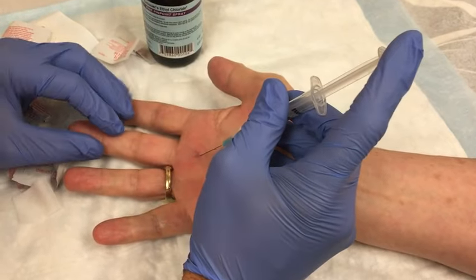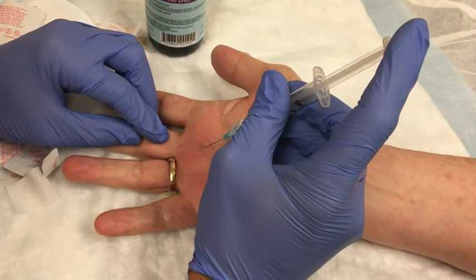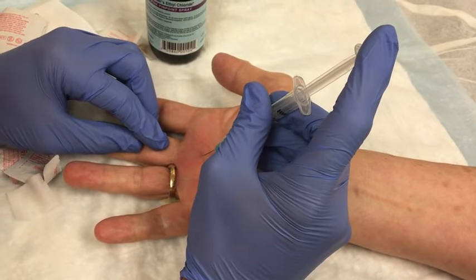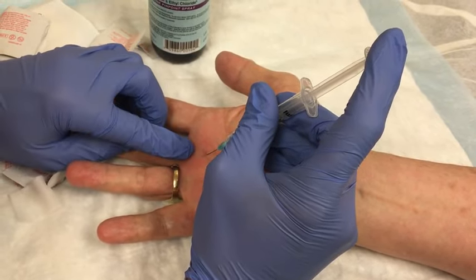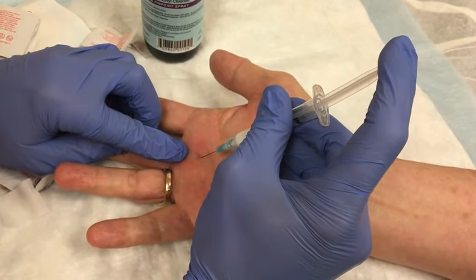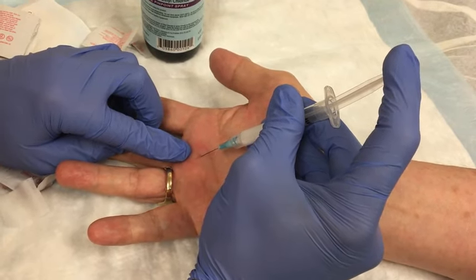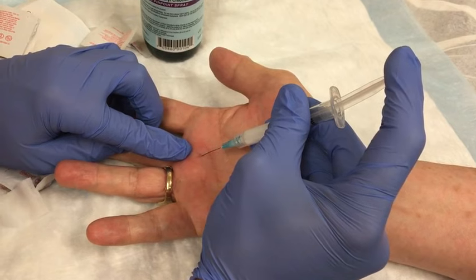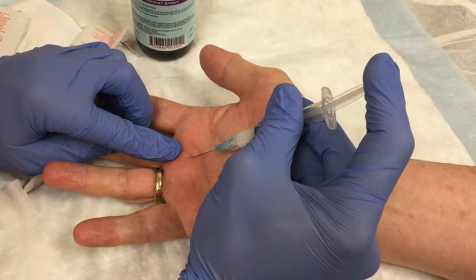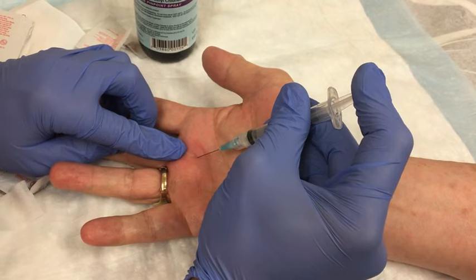What I'll do is go down and touch the bone there. So I'm going to feel the bone, and then back off to get into the tendon. I'm going to put my other index finger in so I can feel the fluid go up the tendon sheath. And inject it nice and slowly. Right there — I can feel that push of fluid go up the tendon sheath. So that's nice. I know it's accurate.